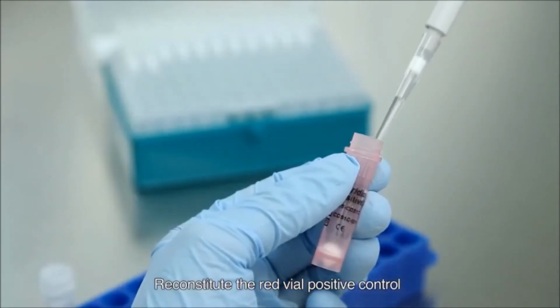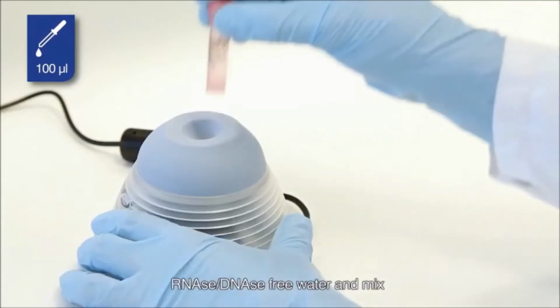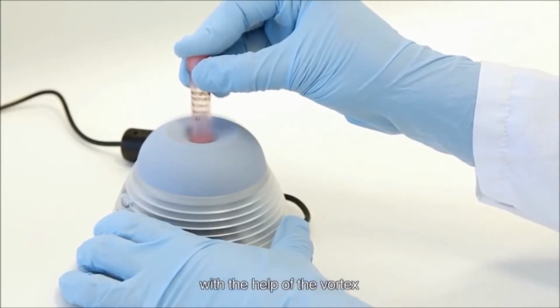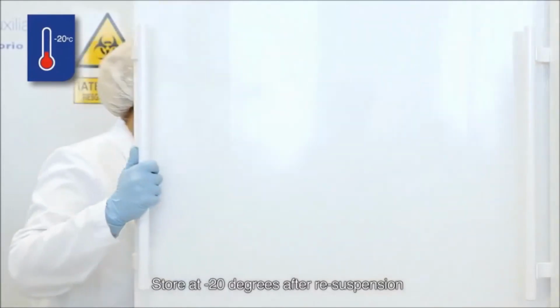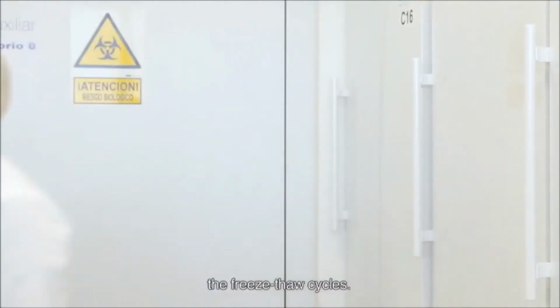Reconstitute the red vial positive control with 100 microliters of the white vial RNase, DNase free water and mix with the help of the vortex. Store at -20 degrees after resuspension and divide in aliquots to minimize the freeze-thaw cycles.